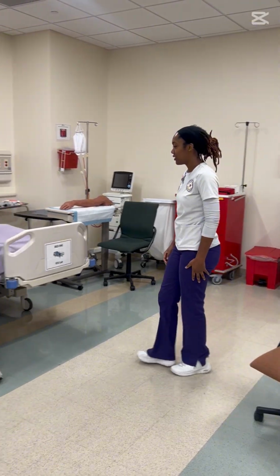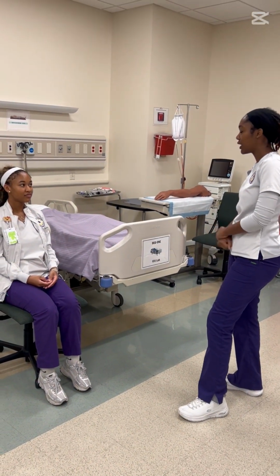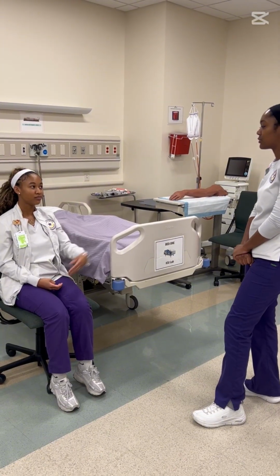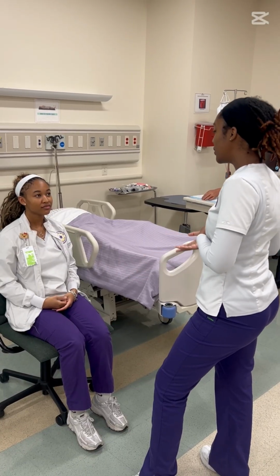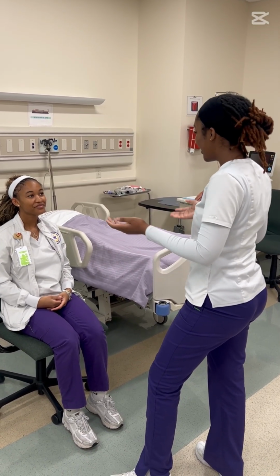Hi, my name is Kiana and I'll be your nurse for today. We're going to perform an ABG blood draw. Can I get your name and date of birth? Gabrielle Cage, 02/17/2003. Okay. Do you have any allergies? No. Perfect.